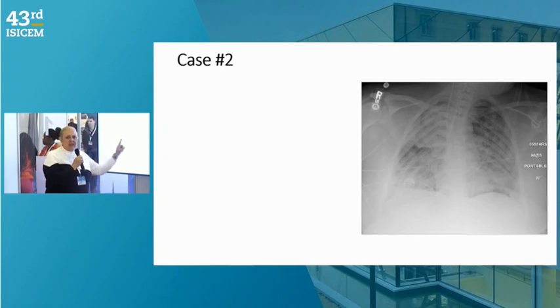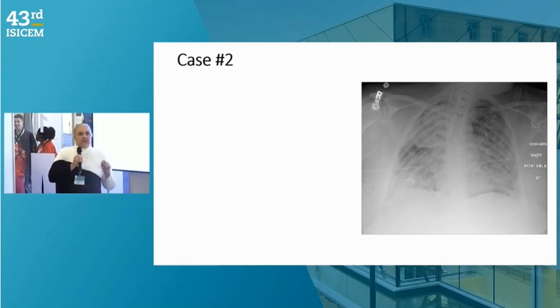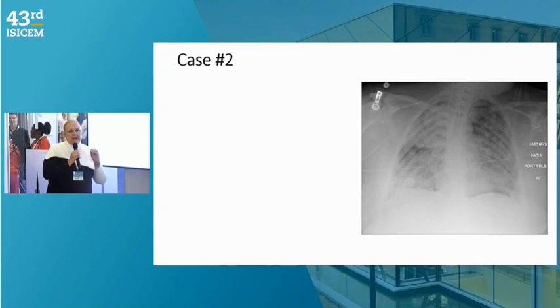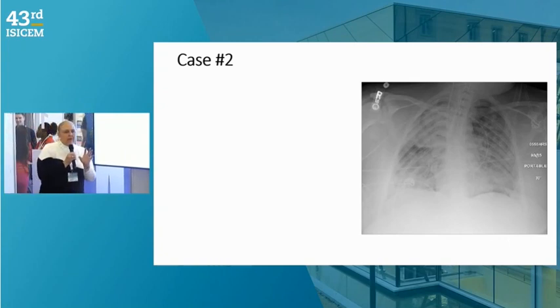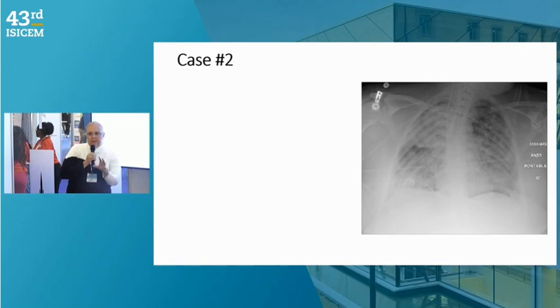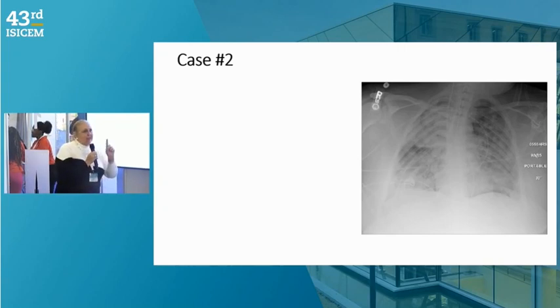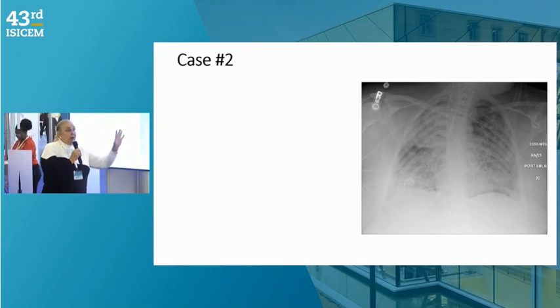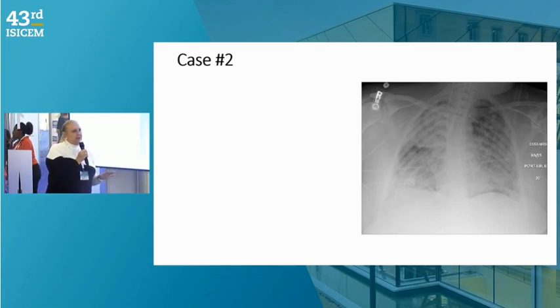Remember that these patients present a fibrotic process, and many people think that fibrosis needs a higher PEEP. Please don't think so. His strategy was perfect because he reduced the PEEP level. Because if you have lower compliance and you increase PEEP, you will be unable to homogenize this lung. So in this case, be gentle with this lung, do not overstretch it. This is one important point because many of you deal with COVID or fibrotic lung processes, regardless of the etiology, and you have to pay attention to the PEEP and the tidal volume.